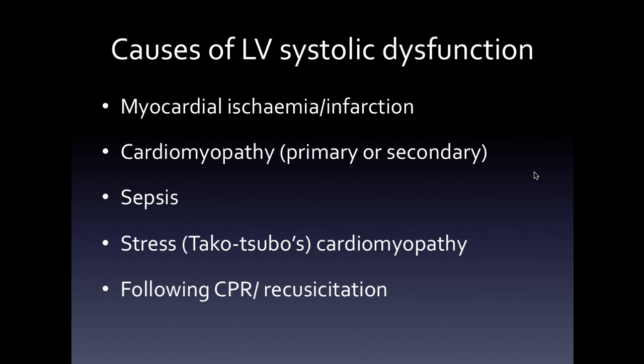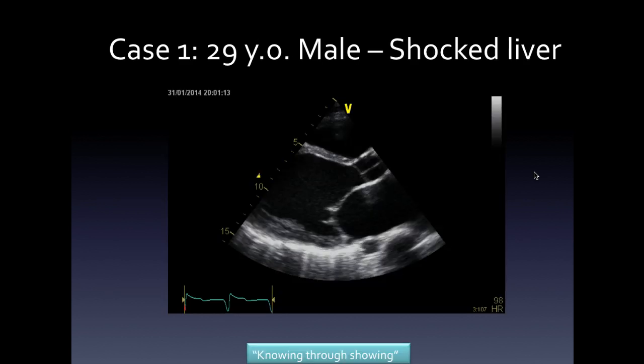It's very hard to interpret, particularly now in the days of cooling, not from an echo perspective. It throws the ECG into wild sort of shapes, and it's actually harder to interpret after cooling, which clearly saves lives. That sort of ends the dogmatic, didactic, dry portion of the talk.